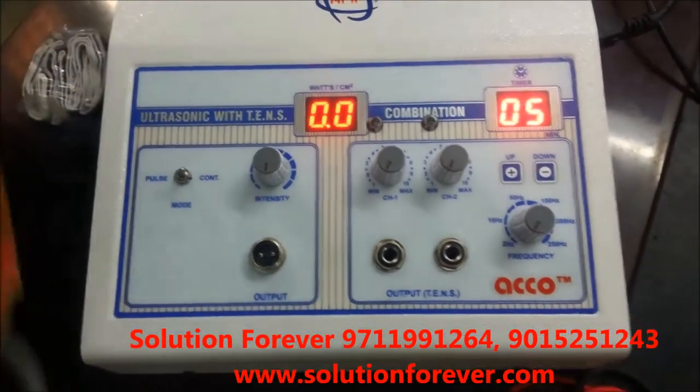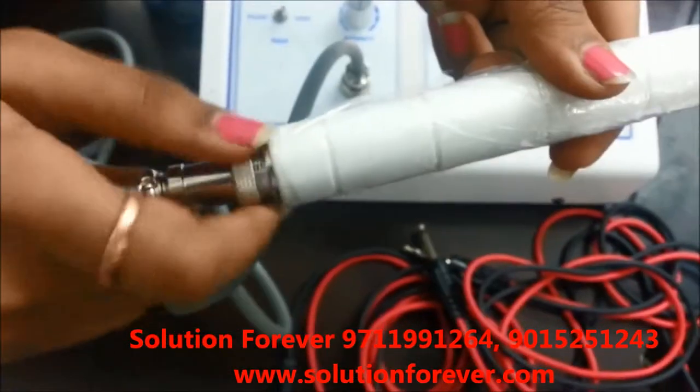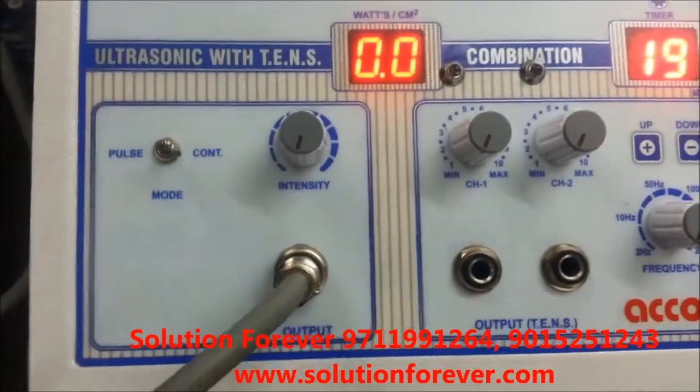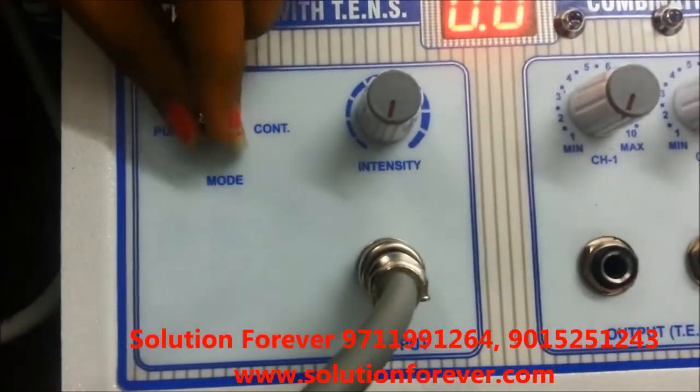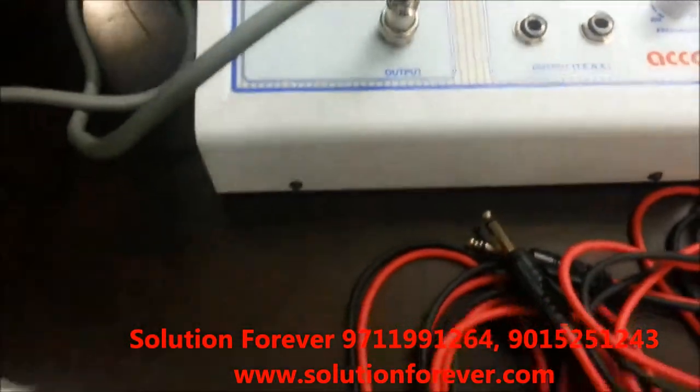Now attach wire and handle. Set the mode as per you need — continuous or pulse. Now increase the intensity as per you need.